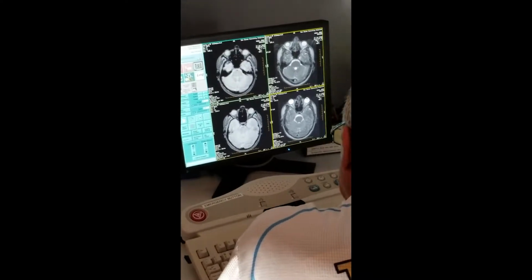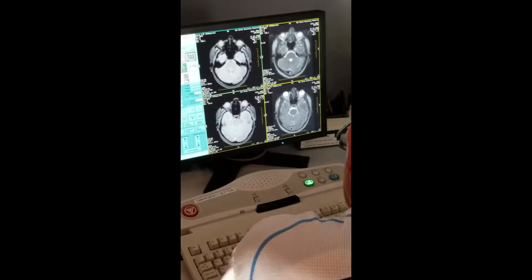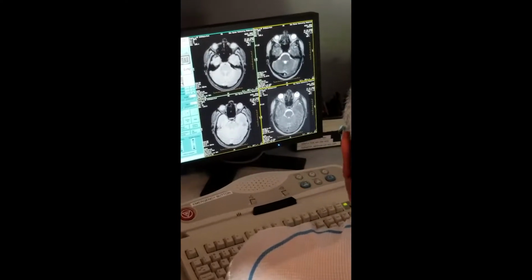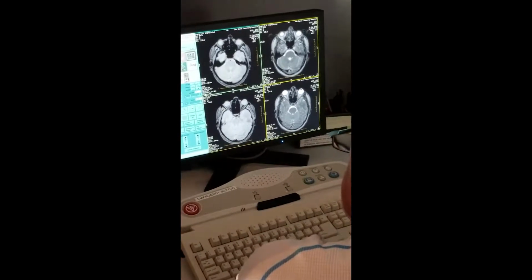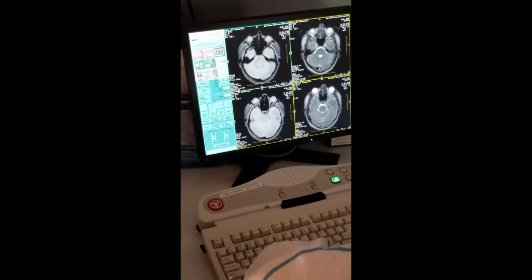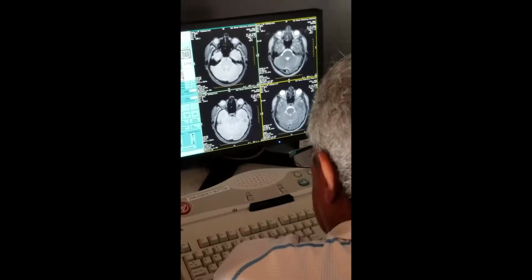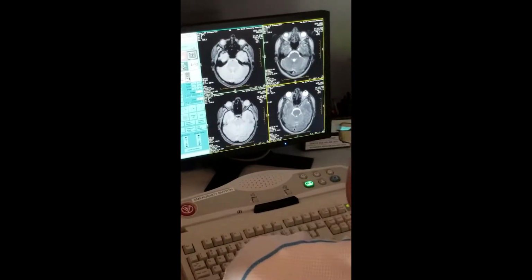How do I know this is T2? TR is what? What's the number? 2800. TE 105. Didn't you use that? That's what you said. So I know this is a T2. And then this is gradient. First of all, it says there. What does it say? Gradient. And what does it say here? SE. Right? So I know this is gradient, this is this. I can even tell by this and by that. So this is image number 9 and this is image number 9.